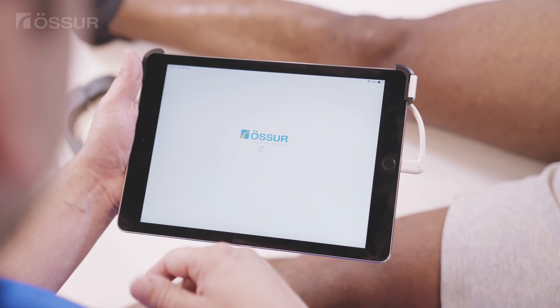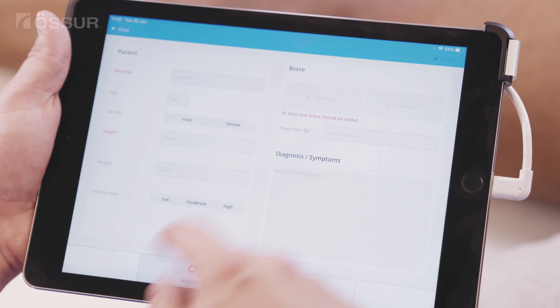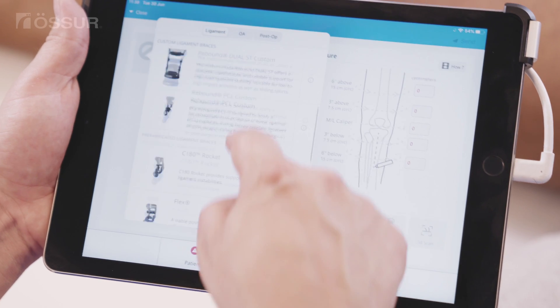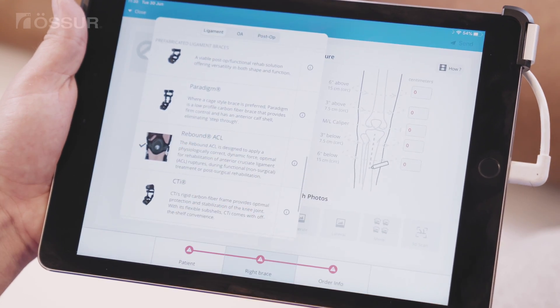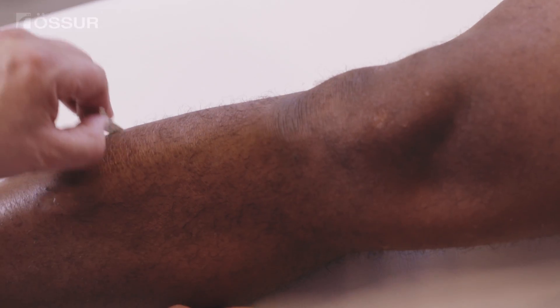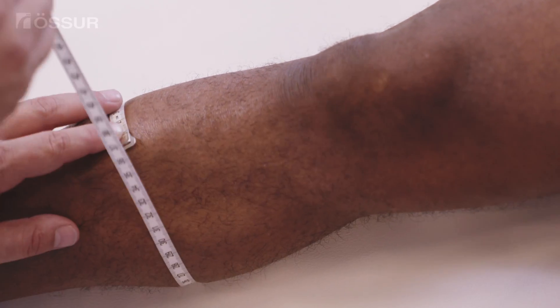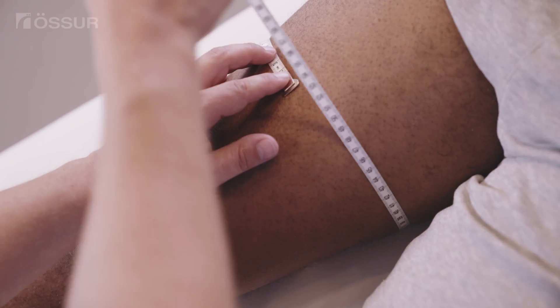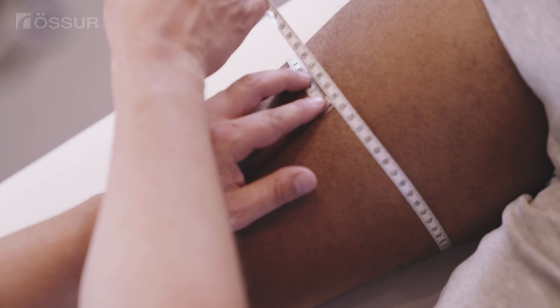To design this custom knee brace, smart measure and/or 3D scanning can be used to capture an image of the knee. In certain markets, off-the-shelf braces may be available. To determine the correct size, measure the joint width using a caliper or by taking the calf and thigh circumference 6 inches or 15 centimeters above and below mid-patella.